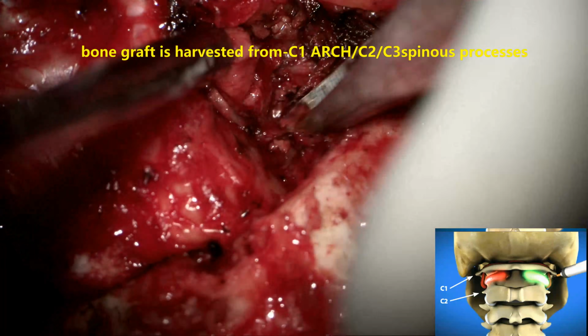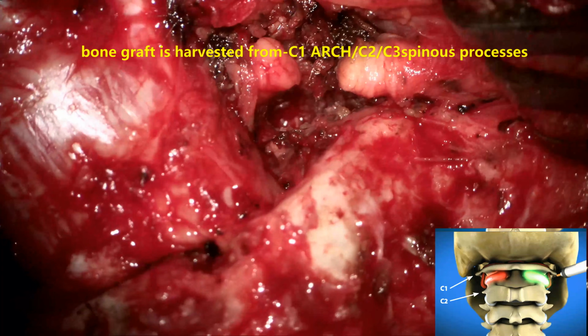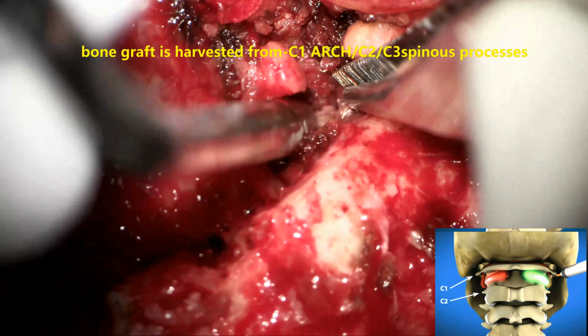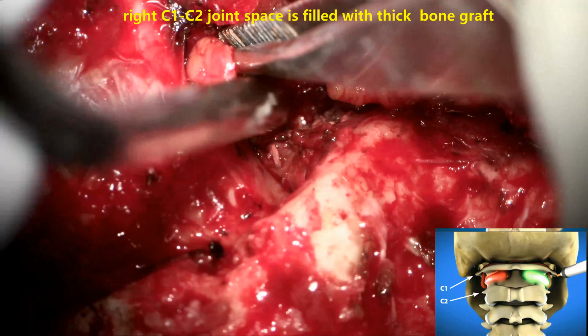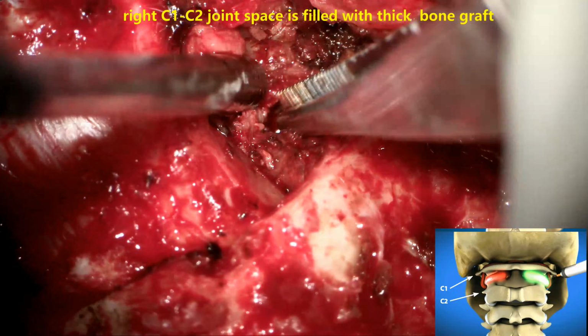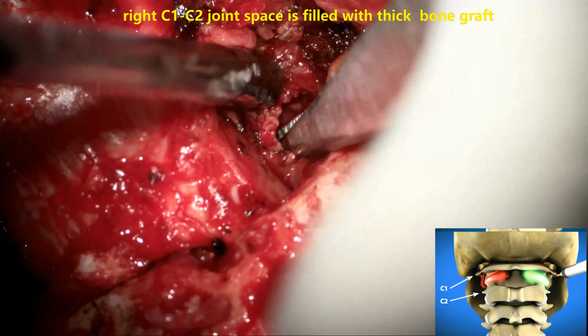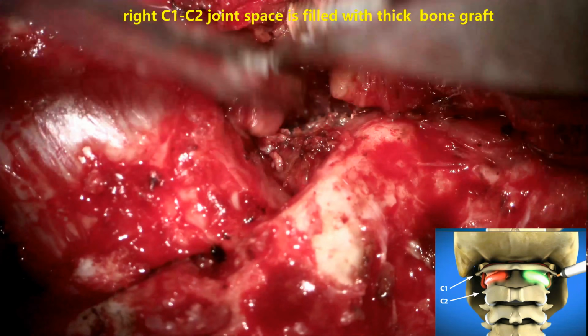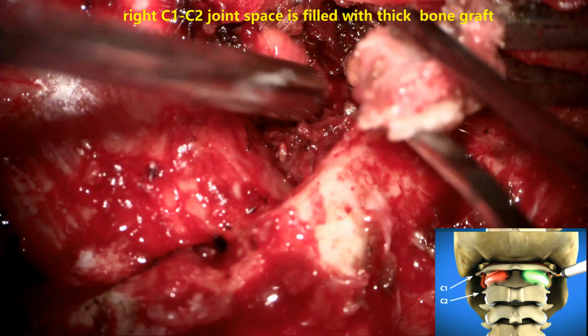We don't have to go to the iliac crest and create another incision and a painful location for the patient. By preserving these bones from C1, C2, and C3, we can have enough bone graft material for these cases and prevent one more incision.